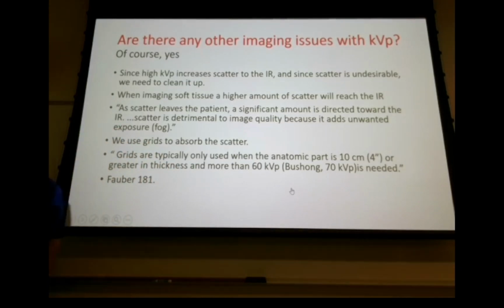So, why is it that you take an X-ray on an asthenic patient, a KUB on an asthenic patient, and the difference in bone and soft tissue just pops? You can actually see the kidneys. You might be able to see the inferior border of the liver, and it's just real black and white. Because you have less scatter.